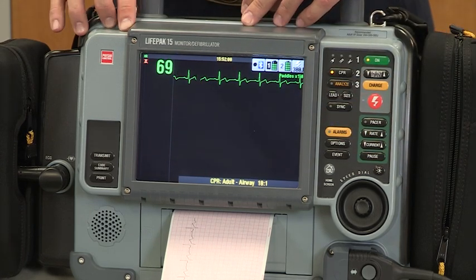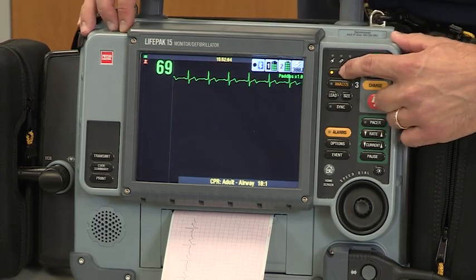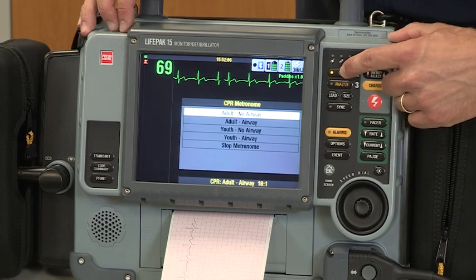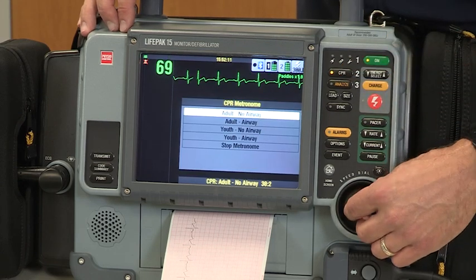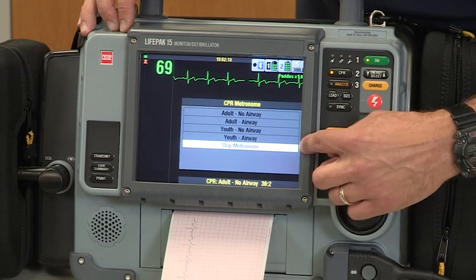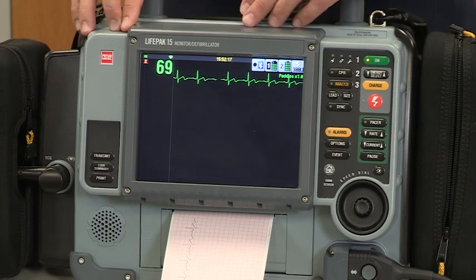If you don't want to see the CPR metronome screen, simply depress the CPR button, and the metronome and the voice prompts will remain. If you'd like to turn the metronome and the voice prompts off, go back to the CPR button, go down to stop metronome using the speed dialer, and depress the button, and the metronome and the voice prompts will stop.